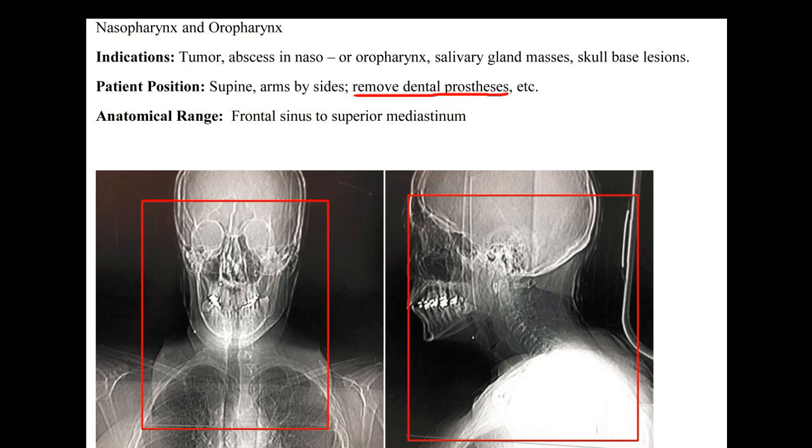But if we refer to this image, we see that we have a dental prosthesis here and here, and then on the sagittal view we can see a large area. And while this doesn't look that significant, when you're actually scanning through, it will really decrease the amount of image clarity, I guess you would say, that you're going to see in this area. And so it can throw all kinds of scatter and artifactual information or noise in this. And so it can really make looking at the level of anatomy in this area very difficult.